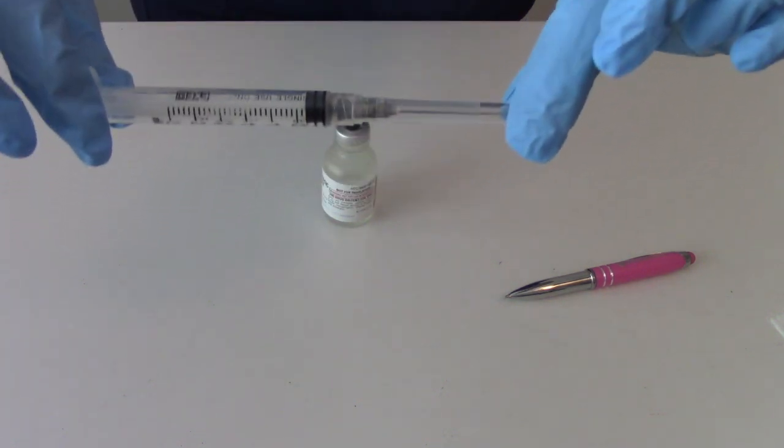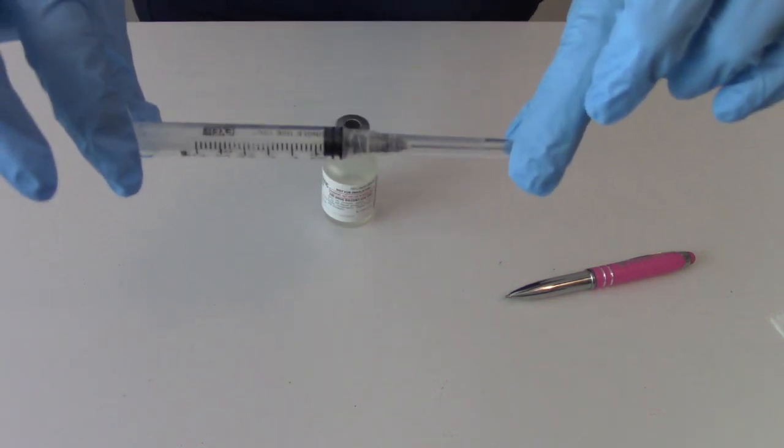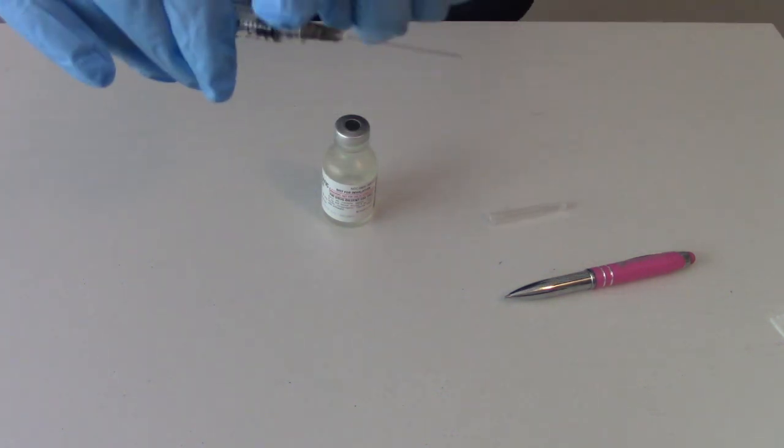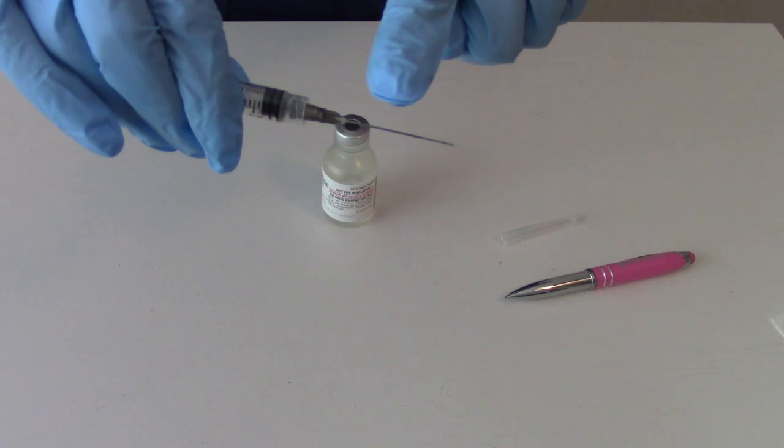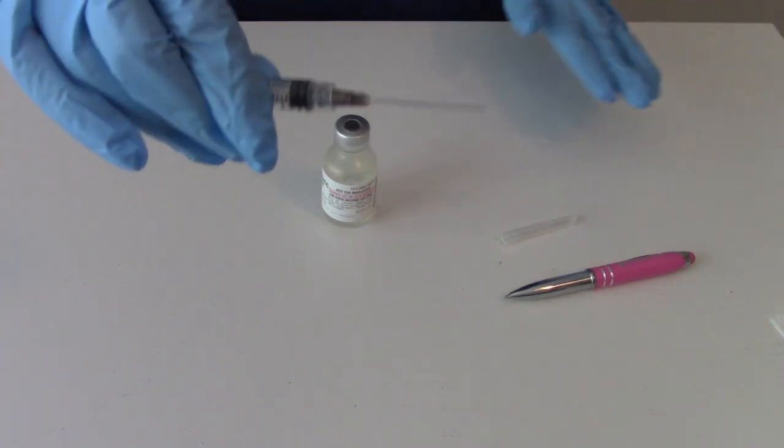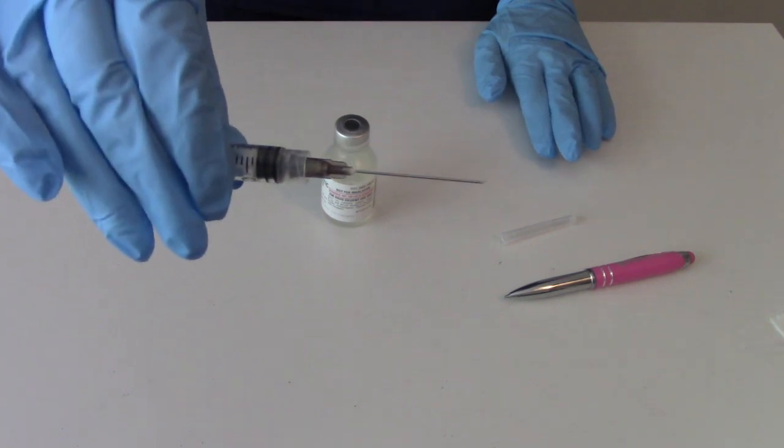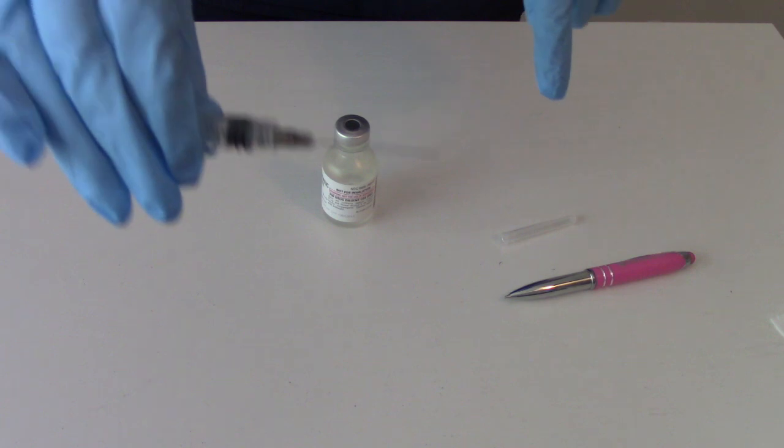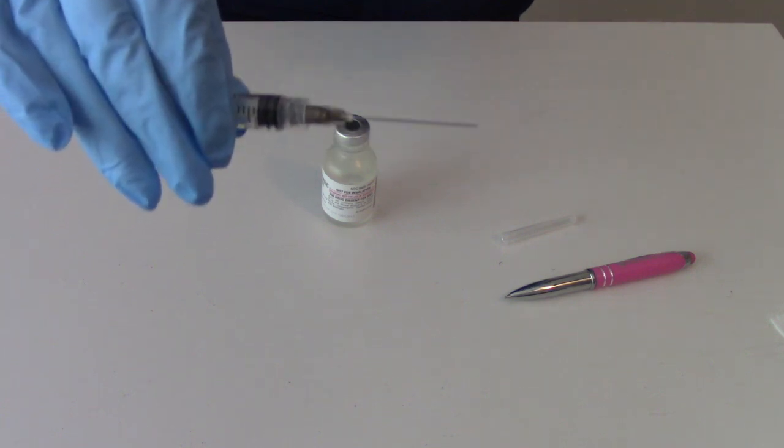This is not a safety needle. If you have access to a safety needle, which is the kind that has a little device on it where you can lock it after you give the injection, definitely use that instead. I just don't have access to it, so that's why I have this kind of needle. And yes, this is a very big needle, this is a 1.5 inch needle. This is something we would use on a much bigger patient.